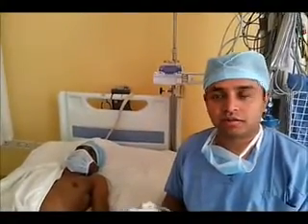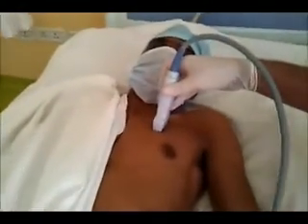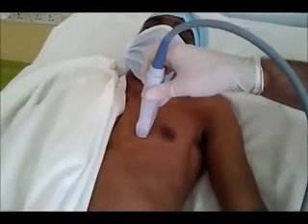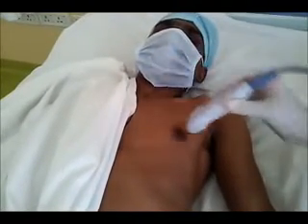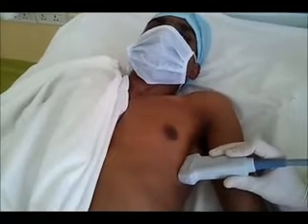To start the ultrasound examination of the chest, we place the linear probe longitudinally from beneath the clavicle, progressing downwards from zone 1 to zone 2, and then laterally from zone 3 to zone 4. When we wish to see between the ribs, we can turn the probe 90 degrees to obtain what is known as the transverse view of the lungs.